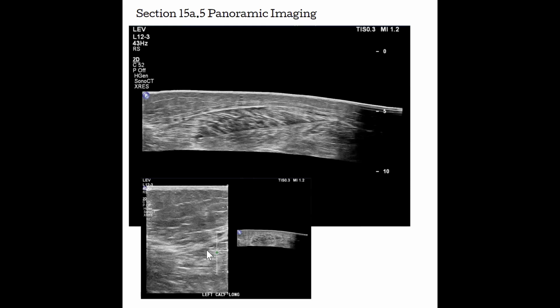This is what it looks like if we were just to have one frame, one 5 centimeter frame, filled up this one little area of our whole calf. And so the sonographer then slid the transducer down the calf. Once it recognized that it was beyond this point, then it started acquiring the next part of the information and then aligned it so it looks like it matches up. And then it just does that the whole way while the sonographer is acquiring their panoramic image.